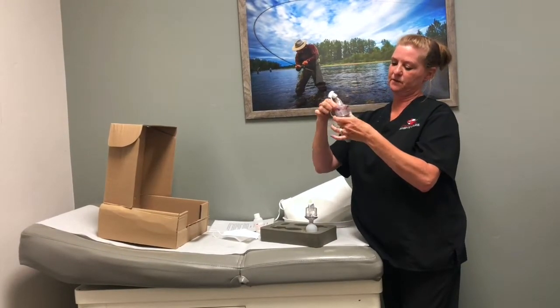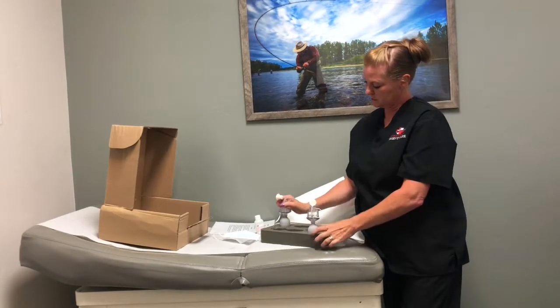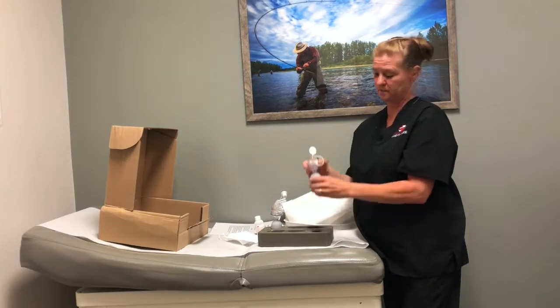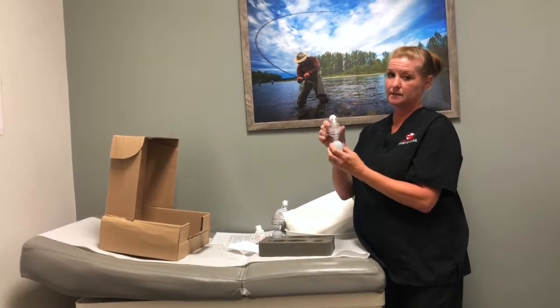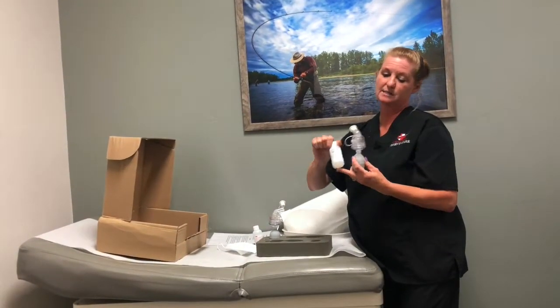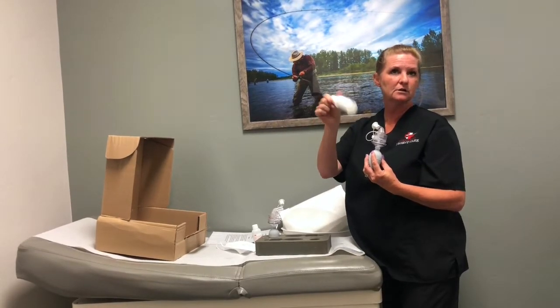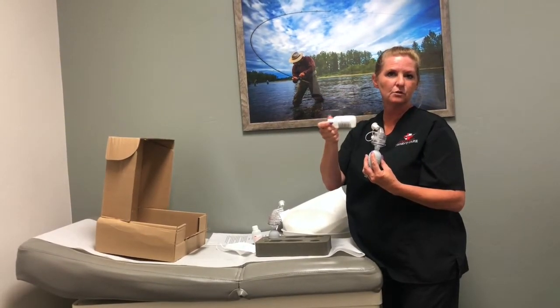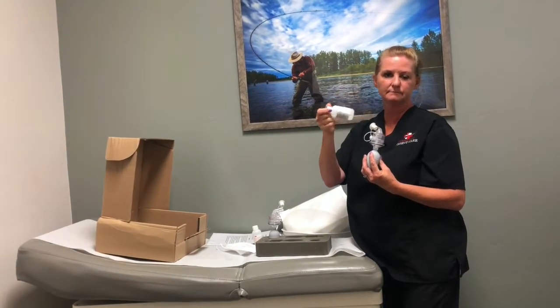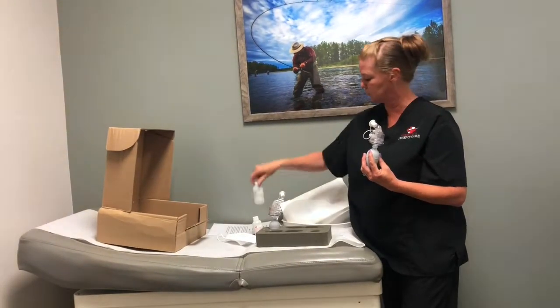I just set all my stuff up before I pull my patient in, just like this, and then it's all there ready to go because it's kind of a little bit of a process. Your second nebulizer is Fit Test Solution 2. It has a black label — don't get them confused. When you've had them for a long time, there will actually form a sugar rock in the bottom of it. It's no big deal; as long as it doesn't say it's expired, you can still go ahead and use it.